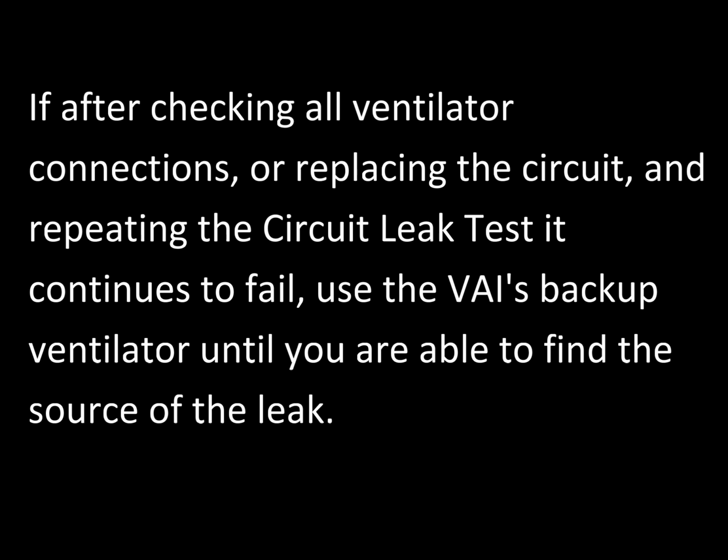If after checking all ventilator connections or replacing the circuit and repeating the circuit leak test, it continues to fail, use the ventilator-assisted individual's backup ventilator until you are able to find the source of the leak.